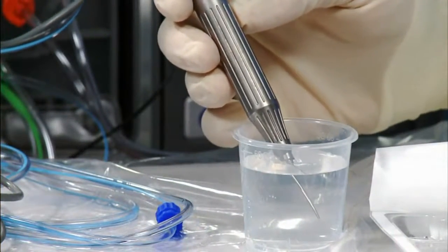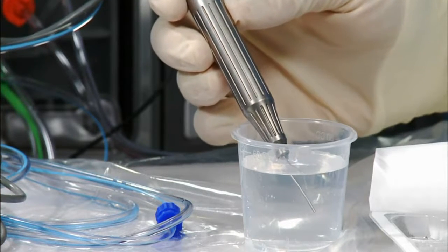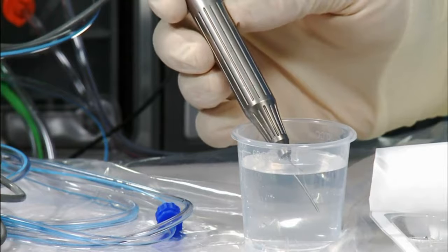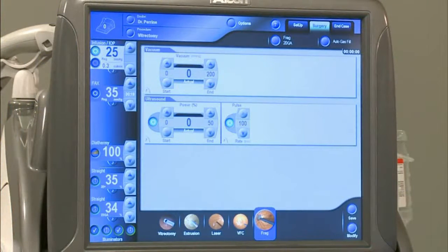Submerge the front end of the fragmentation handpiece in the fluid container. Take care not to touch the tip to the side or bottom of the container. Press the Play button. This will tune the frag handpiece. When the frag tuning screen appears, fragmentation is now available.